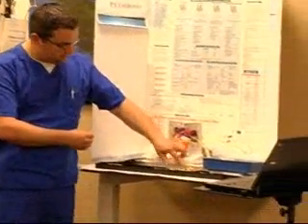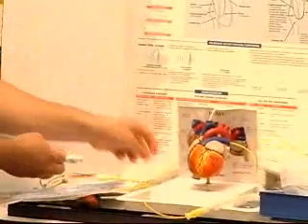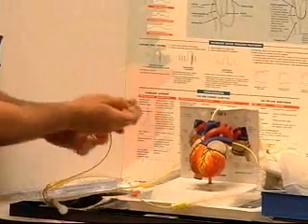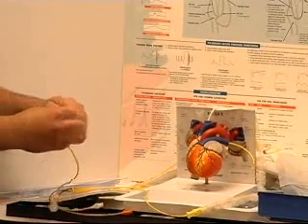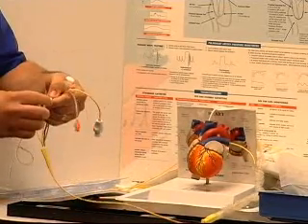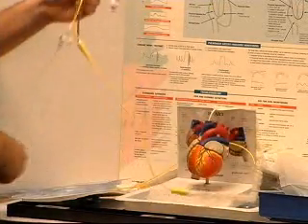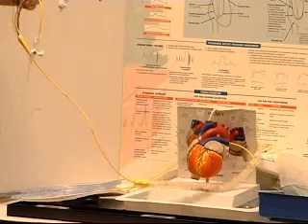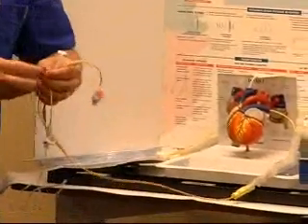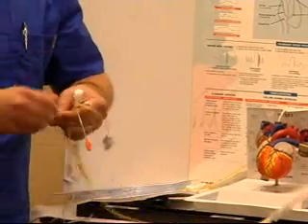Everybody still see? So this is my PA that I had connected. And get this connected all the way here. It can be a little tedious. There's a lot of different lines. Like I say, if you forget which one's which, it's got the little reminder on the tip. It was nice to have that paper already on there because otherwise it would have hit the floor already. And guess what? That means you get to prime a new system.